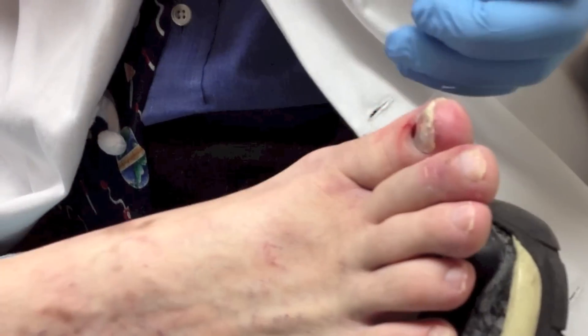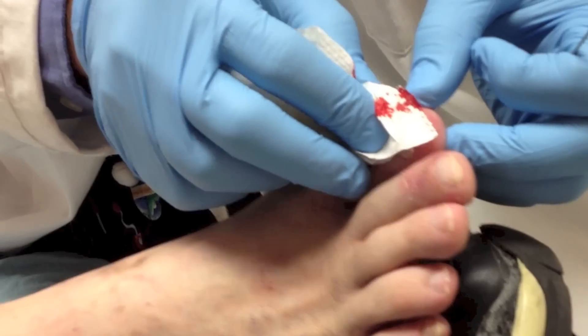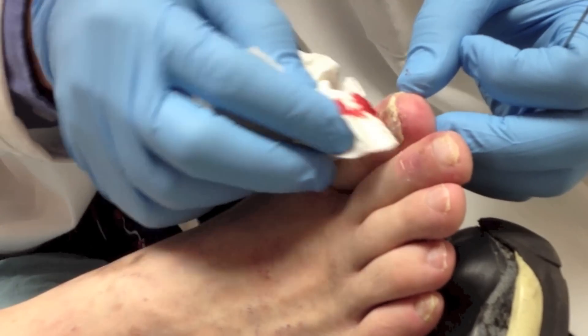Sorry sir — did it get to a sharp pain or just pressure on the toe?